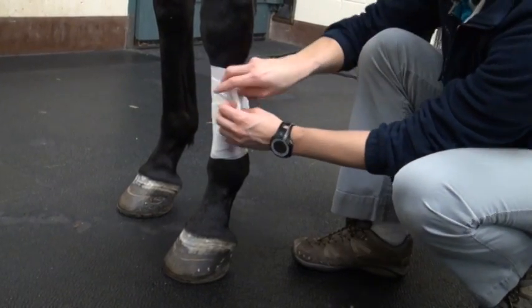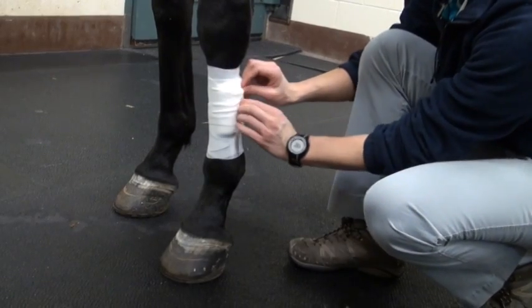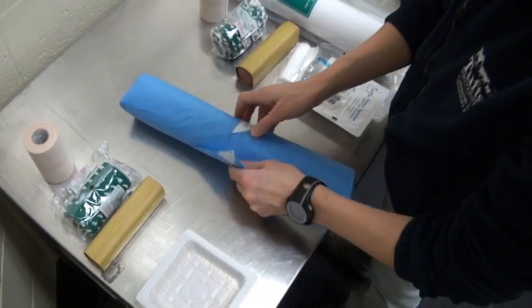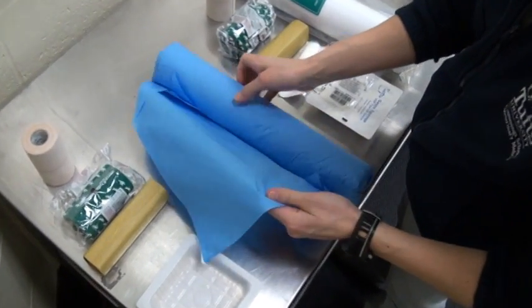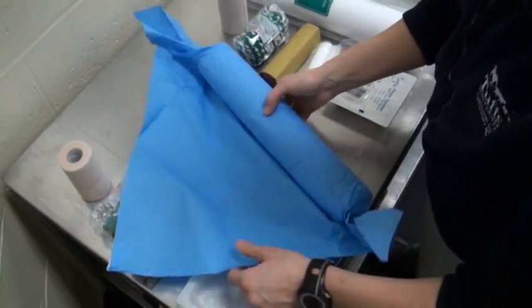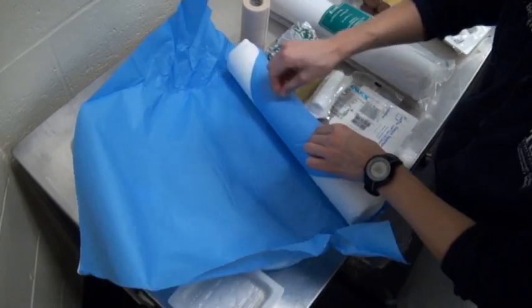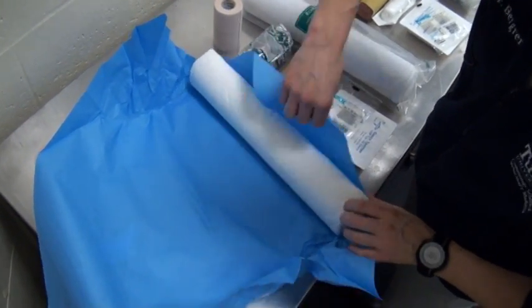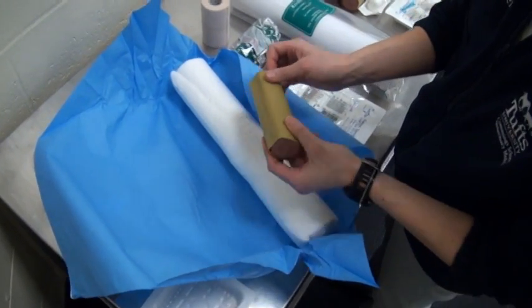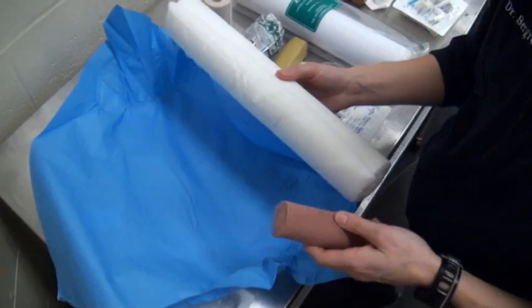When you reach the end of your roll, you can tuck the end in order to hold it in place while you get ready for the next layer of your bandage. So once your roll gauze part is on, the next step will be the sheet cotton. This will come in this blue outer casing to keep the sheet cotton sterile. As you open it again, you want to not touch it excessively, although it's okay to touch it to some extent as you're going. So the sheet cotton will be held in place with the brown gauze. That comes in this paper tube. You can pull that out, and then you'll take your sheet cotton to apply to the limb.